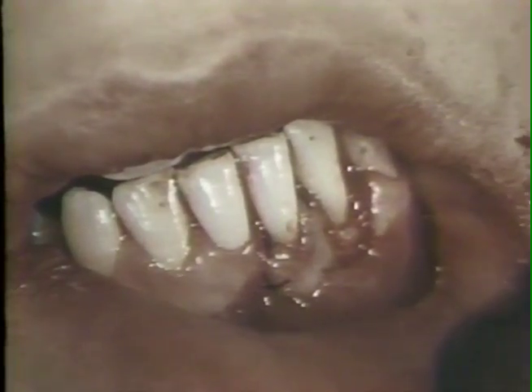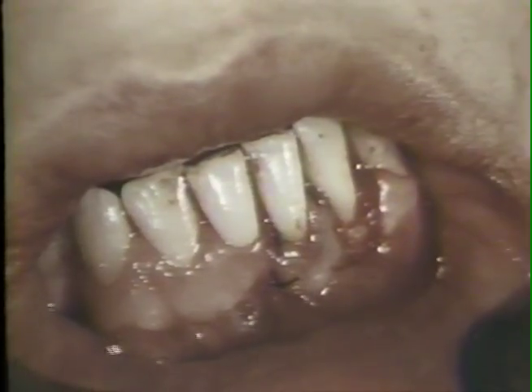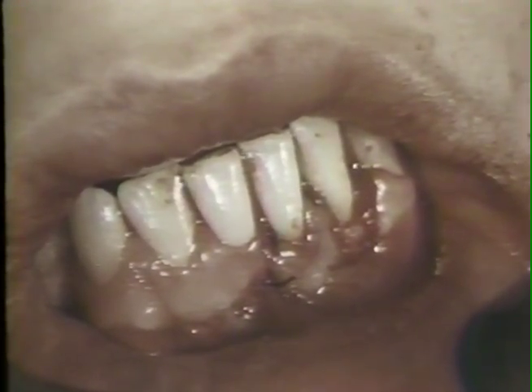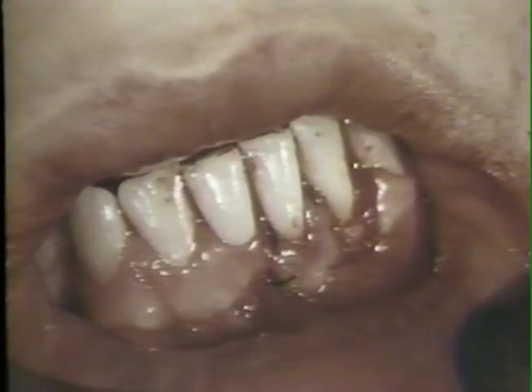Here another suture has been placed at the mesial border of the flap to hold it securely in the desired position. There is no lip pull on the flap. The knot of the suspended suture is shown on the lingual aspect of the tooth that had the labial cleft.